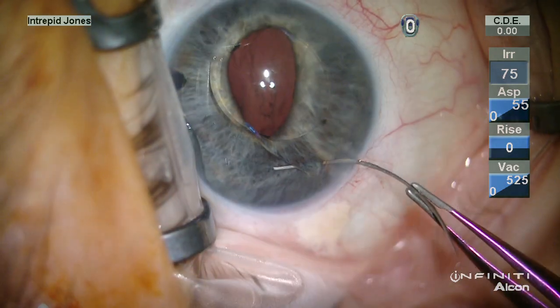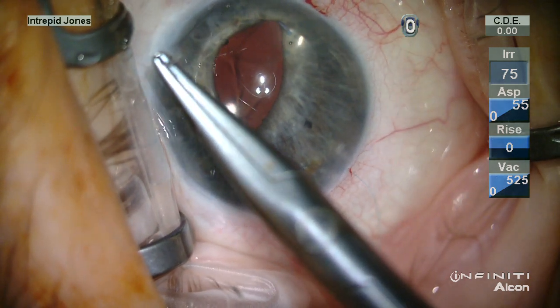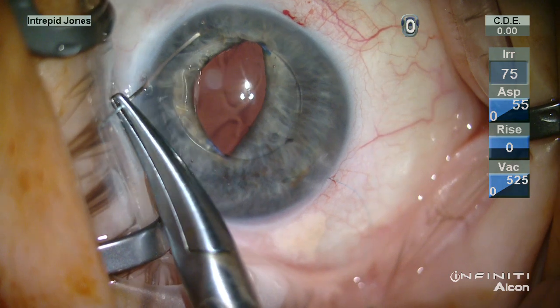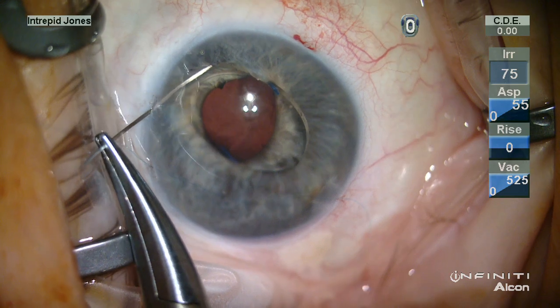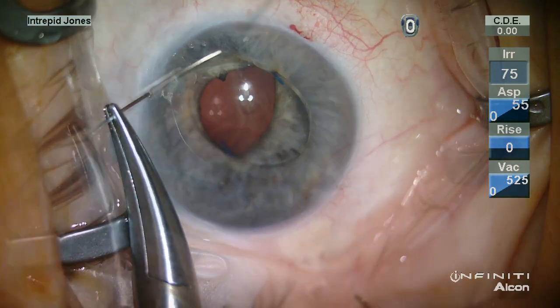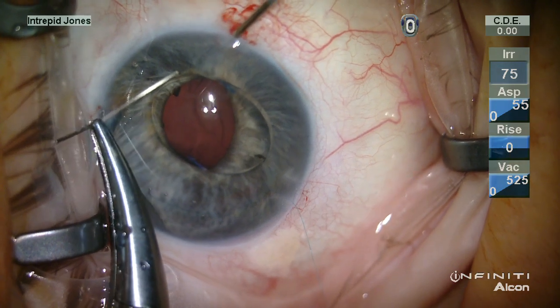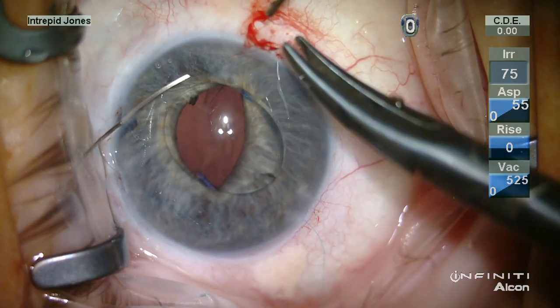10-0 Prolene sutures are then passed under each haptic and through the iris using paracenteses and capturing the needle in a 27-gauge cannula. This is less traumatic to the tissue and less tension and pressure is needed for passage of the sutures in this regard.